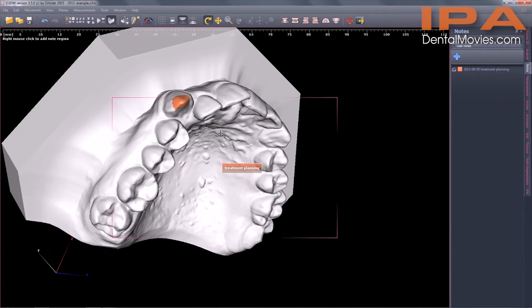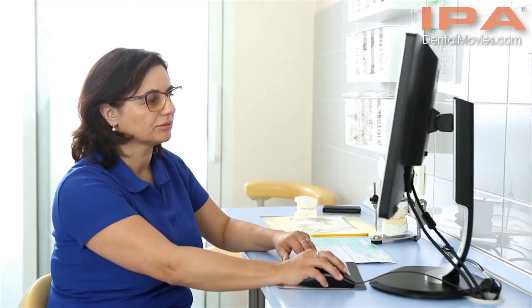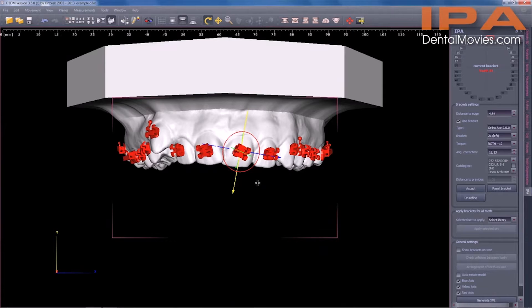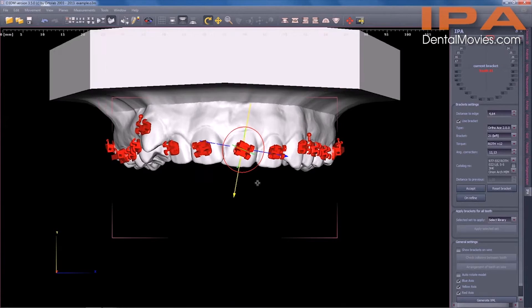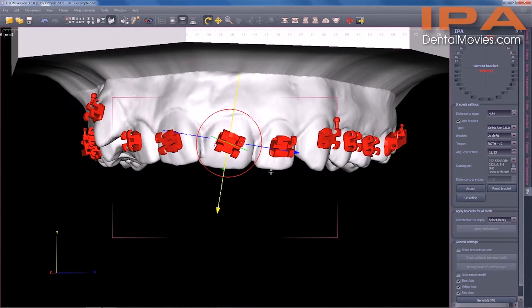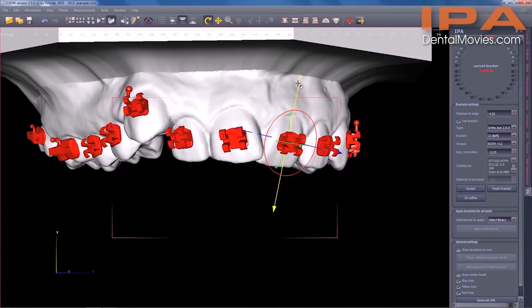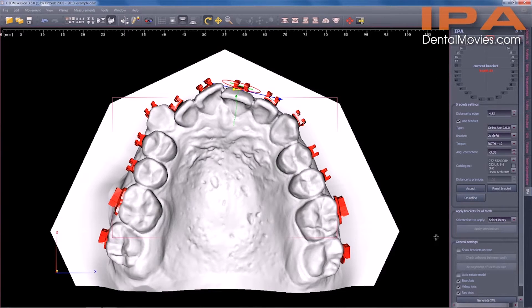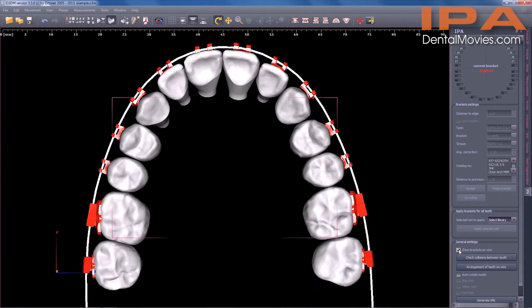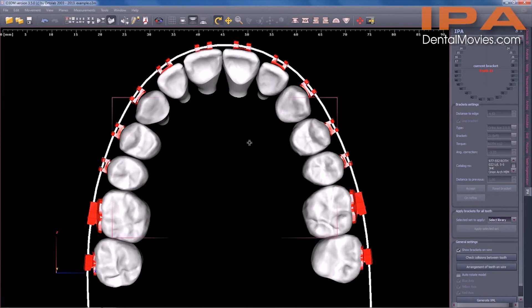The key to successful orthodontic treatment with a fixed appliance using the straight wire technique is correct planning of the bracket positions of the teeth. The IPA system offers perfect planning on the computer screen, in comfortable conditions, in a quiet room, supported by semi-automatic positioning of brackets. The library offers many types of brackets in their combinations.